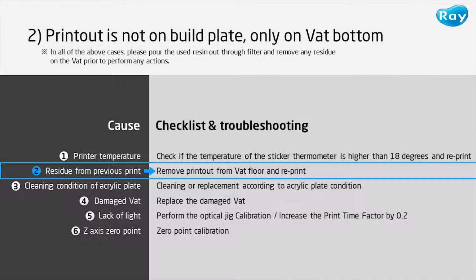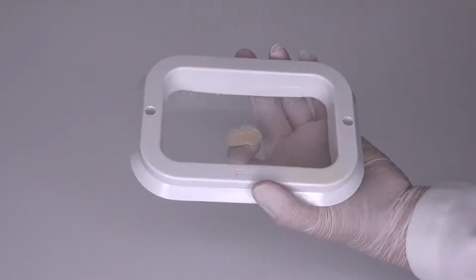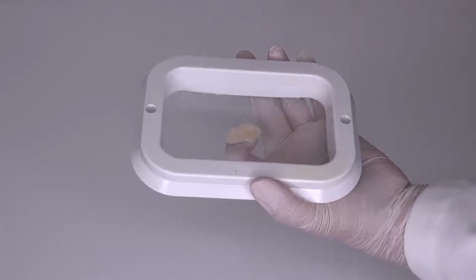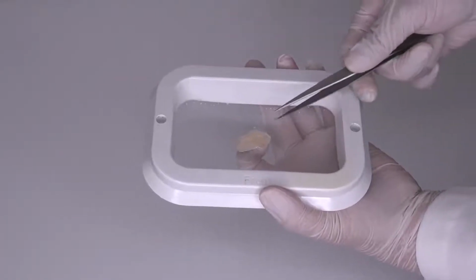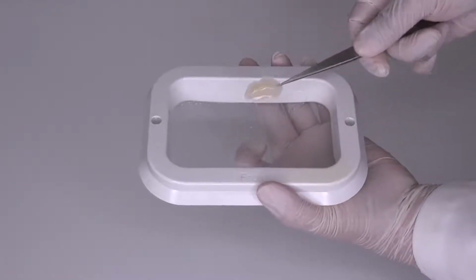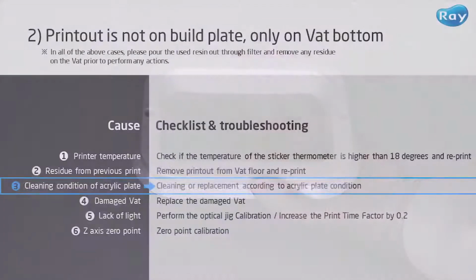The second cause is residue from the previous print. If residue floats in the VAT, it will interfere with the light partially, which leads to print failure. Pour the used resin out through a filter, and if there are failed printouts attached to the bottom of the VAT, slightly lift them up from beneath the VAT with a clean finger and remove them with tweezers.